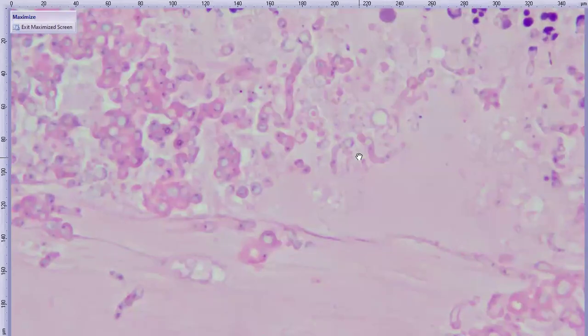Do you have a PAS stain of this lobe? I don't. Go ahead. So somebody else piped up and said Candida albicans yeast will be round, so anything oval will be the beginning of a pseudohypha.